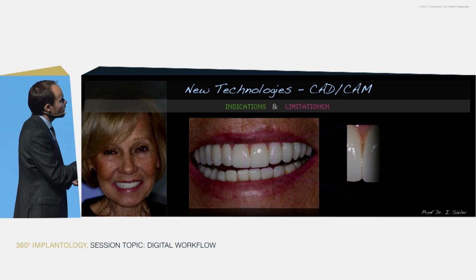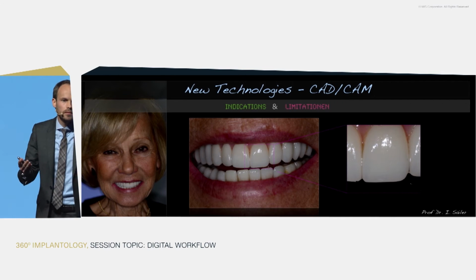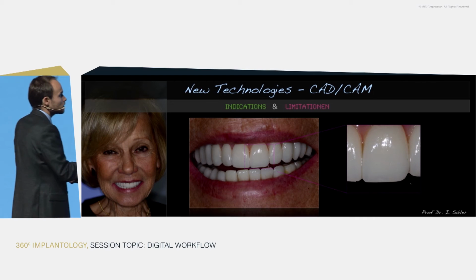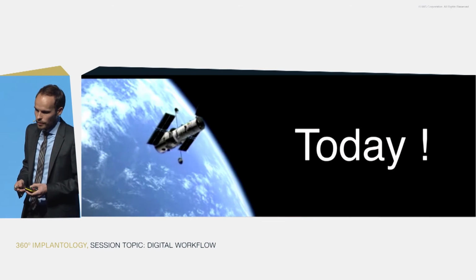By adding these colors and stains, you can even achieve something like translucencies out of monolithic reconstruction, which I've never believed 3 or 4 years ago. But today, the industry offers all of this. So here, I think we can give a great benefit to our patients.